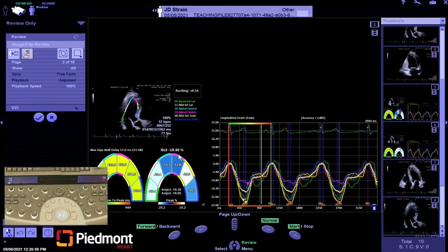Sometimes this could be purely because of the image quality, and see if another sonographer can attempt to put their hands on the probe and acquire a different data set. Sometimes this could be because of a poor EKG signal, or again, in essence, could be that the patient image quality is just too degraded to track. So those would be my suggestions if strain was not tracking properly.